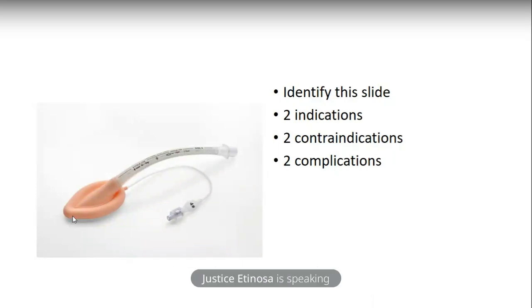Okay. Laryngeal mask airway. Face mask. Okay. Thank you. Laryngeal mask airway. So this part here is a part that sits on the larynx. You can see it, right? You can see my cursor, right?